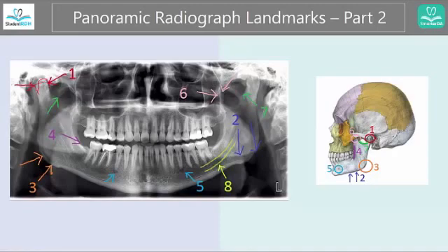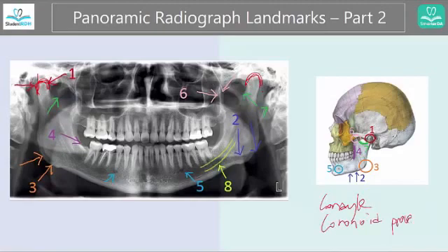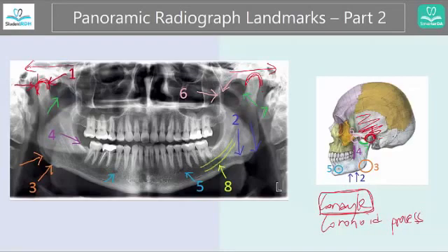Number one is this protruded, rounded part. This is either the condyle or the coronoid process — which one do you think it is? The answer is the condyle. The condyle is the area that rubs against the temporal bone; together they form the TMJ. This part towards the edges of the radiograph is the condyle, versus the coronoid process which is going to be towards more the midline.